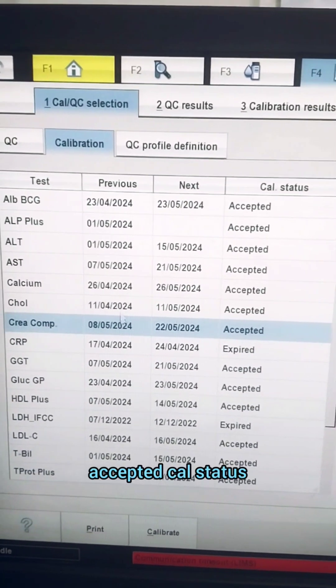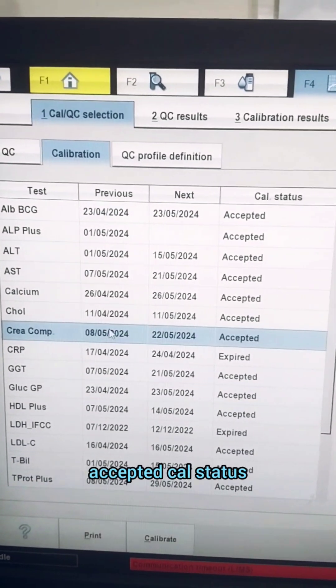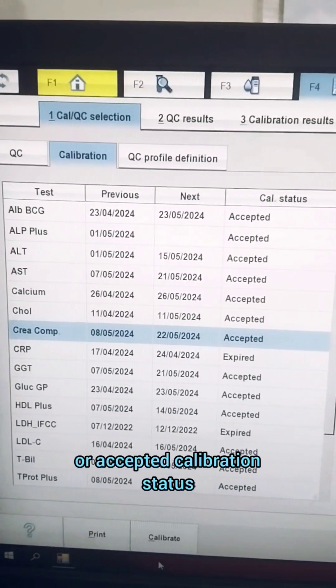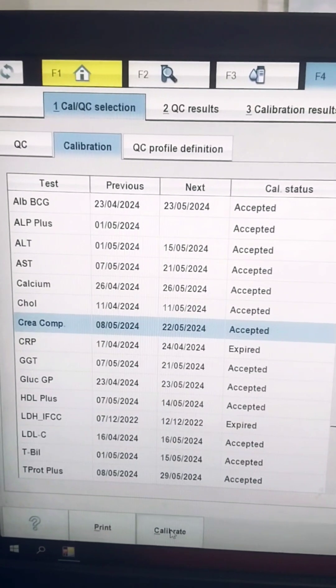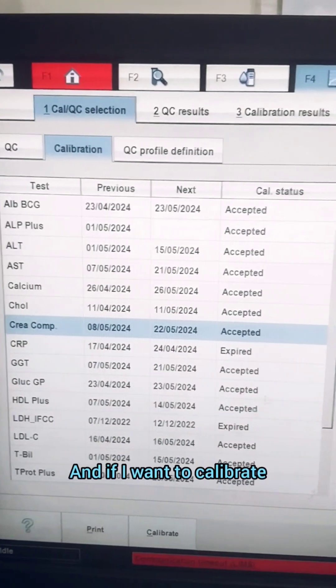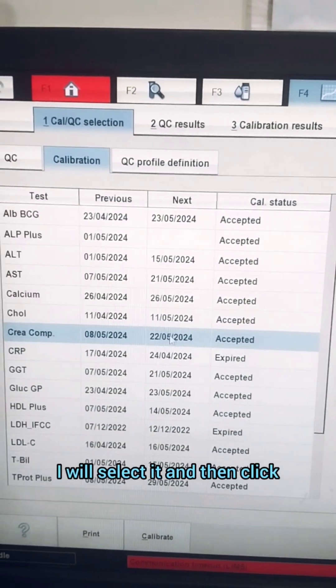Coming back to the machine, most of my parameters are showing an accepted calibration status. If I want to calibrate a certain parameter, I will select it.